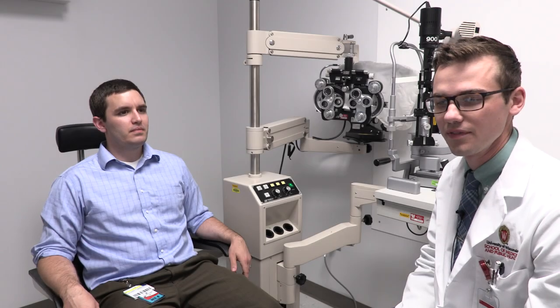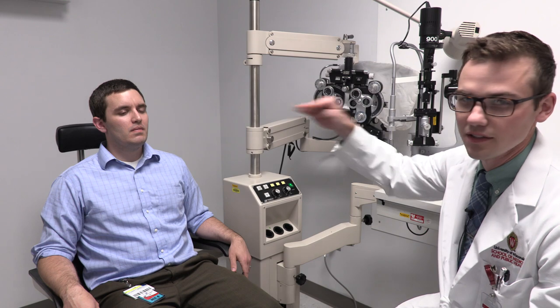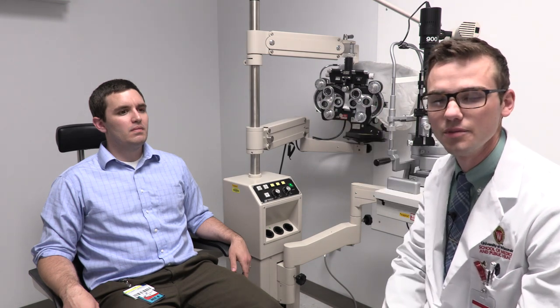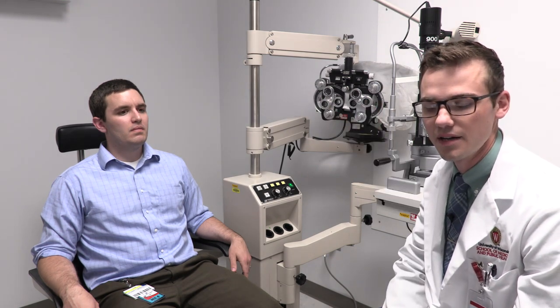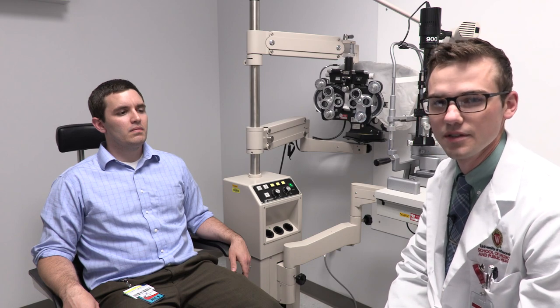In order to perform red reflex testing, position your patient so your eyes are level with theirs and dim the room lights for better visualization of the reflex. In this case, we'll leave the lights on so you can see the technique.